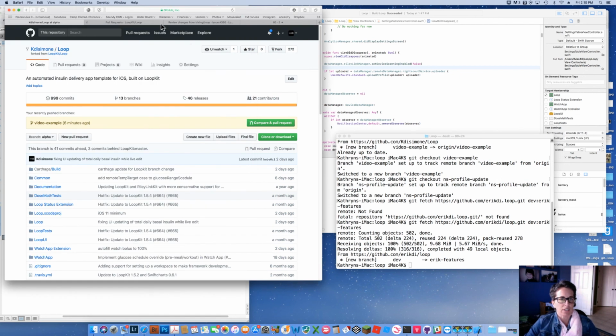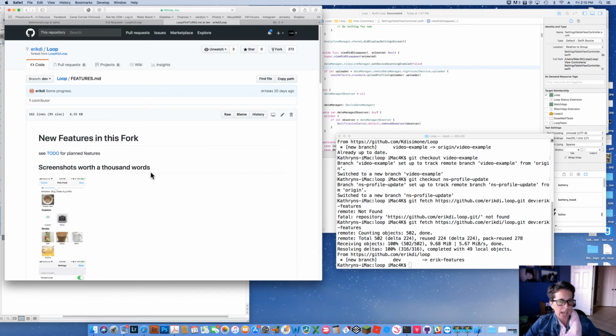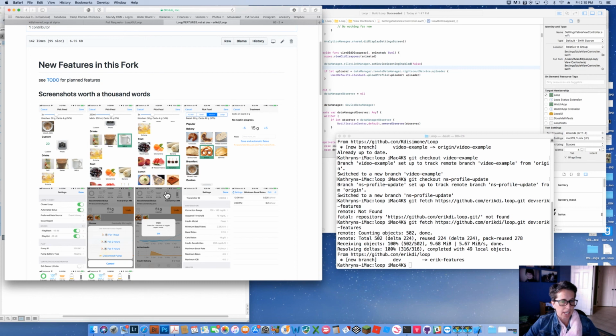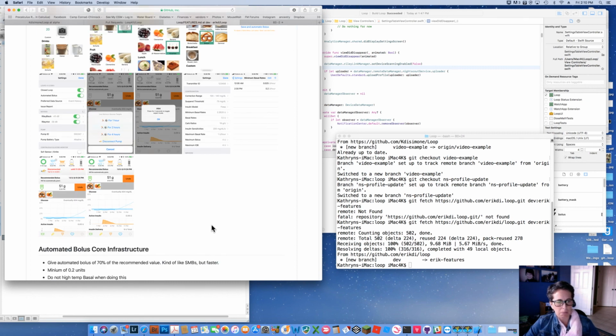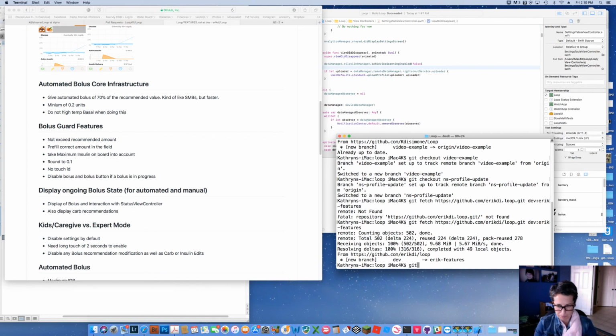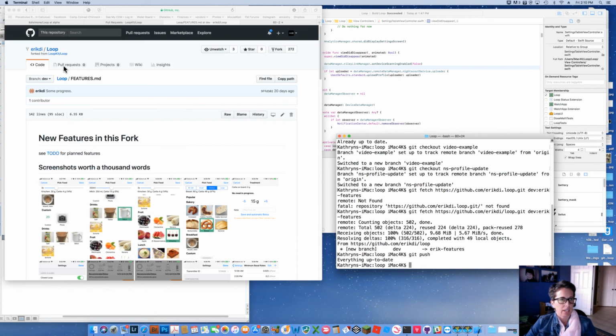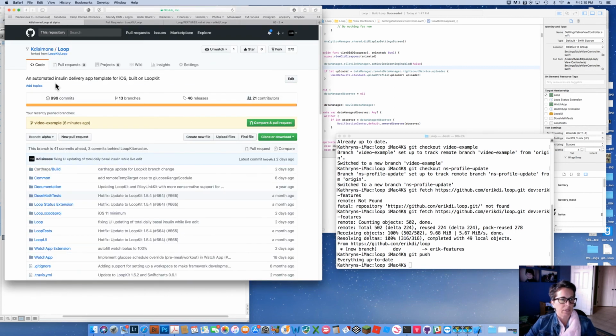So Eric had these really cool features that I found when I was looking at the issues over on his. He has customizations for his branch. Maybe I want to check them out and pull and pick, do something, but I want a branch over in mine to build from and play with. I can do that. I can pull it in. I now have a branch called that. I can push, everything's up to date. I can go over to mine and I can see my branches.